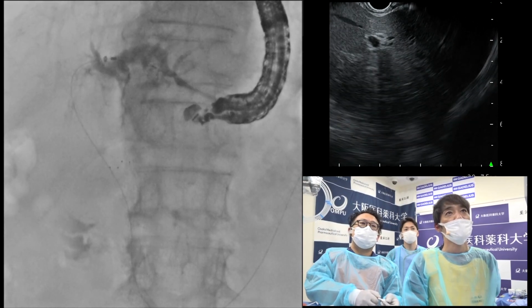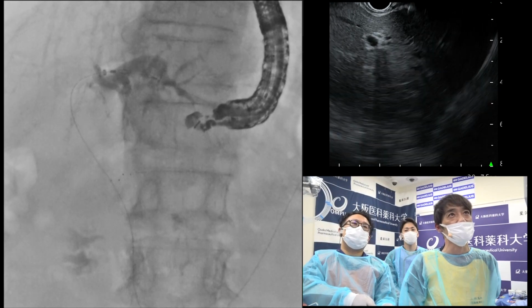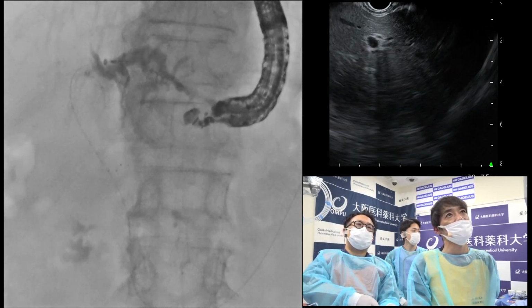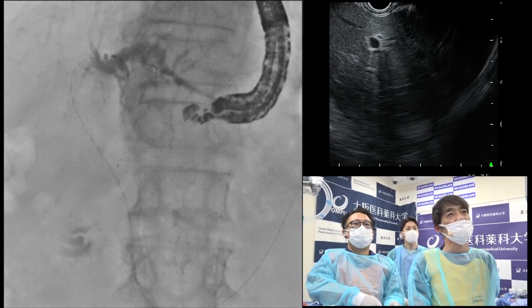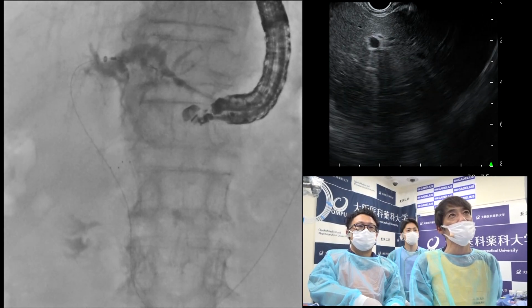By doing so, we can obtain the adhesion between the hepatic parenchyma and the stomach wall. And then to prevent focal cholangitis for B2, an anchor band site is placed as shown in the fluoroscopic image.